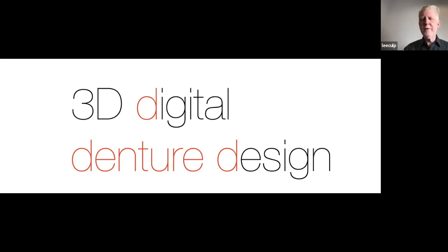But because there's so much of a gray bar there, you can do two things. You can opaque the bar or kind of make the bar pink first, which is a step I don't want to go through. So there's actually a very, very opaque cement that's designed for implants. It's basically designed from Multilink, but it's white and it's really opaque.